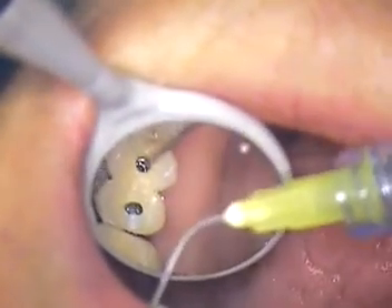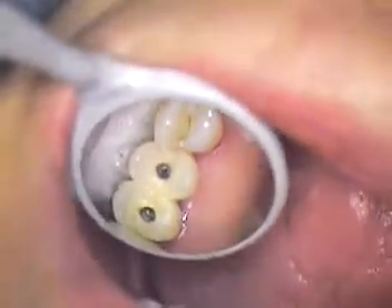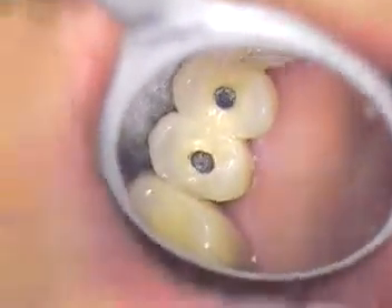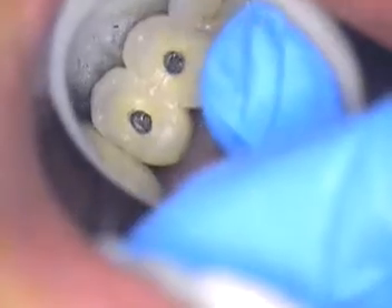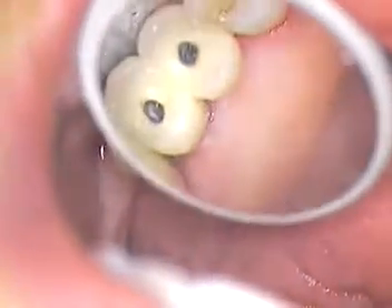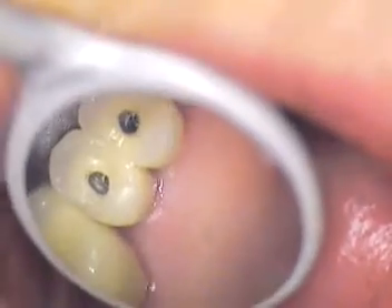We'll start off by just drying off the two orifices. We know we're going to go a little more lingually with number 14. We're seeing now for the first time the fact that we may have two types of screws. One's a flathead screw — it's on the lingual. We can see that. It's located way toward the lingual on this tooth, number 14.